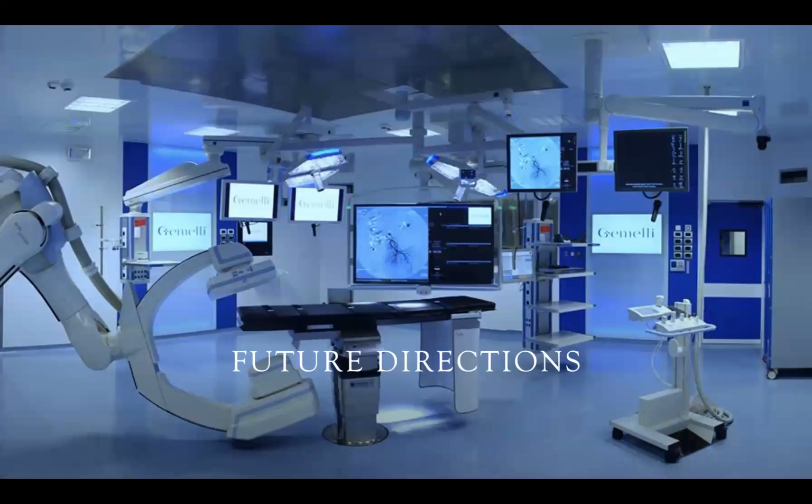And I would love to see us eventually move to a hybrid room suite where we have a hybrid room with all of the imaging technologies available to us and the robot to be able to provide us with improved dexterity, improved visualization, and increased capacity to do more things that we otherwise are limited by using our current technologies.